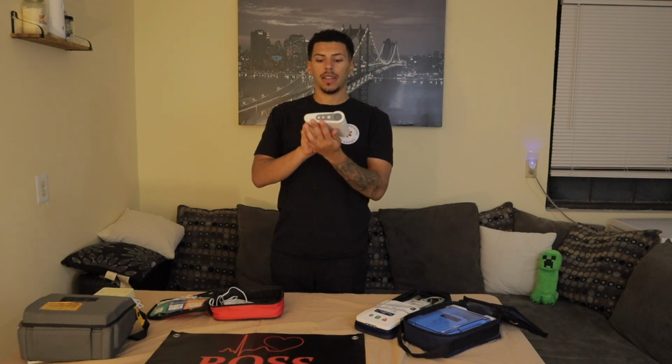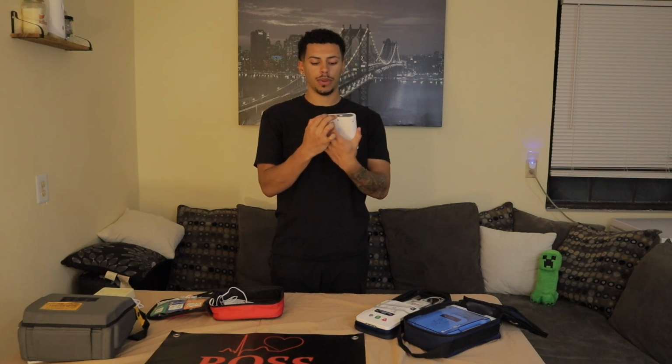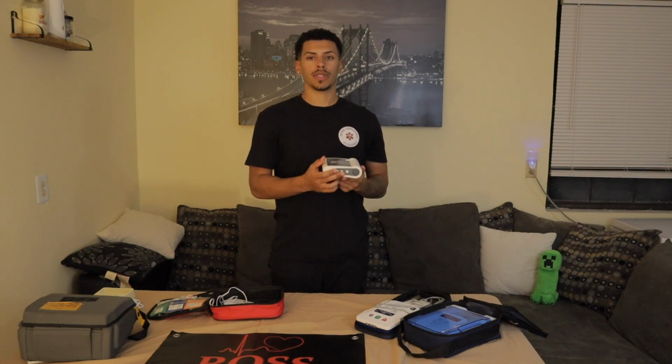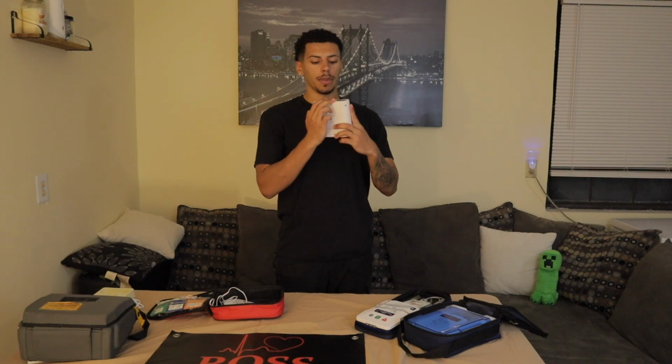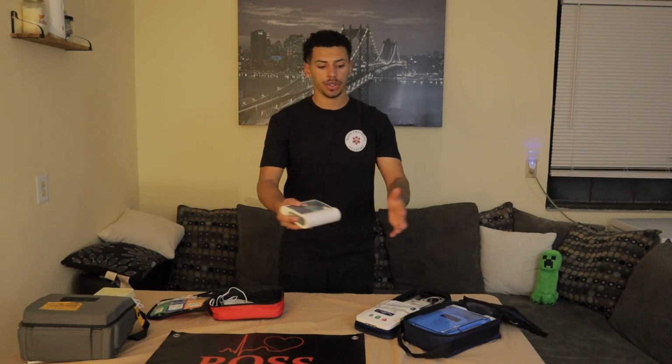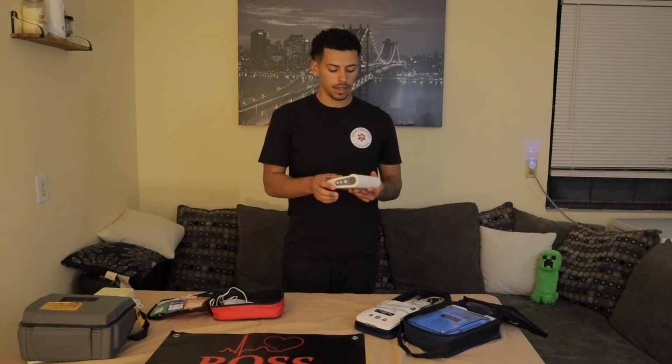Over on the other side, you have a couple buttons. This will be how you change to your other language source. So it's typically going to be English and Spanish, and you'll just hold these two buttons to switch between those. Another one's just going to be this pause button. So when you're running a scenario, you can hit the pause button, stop the scenario, tell your students what you want to tell them, and then resume exactly where you left off.